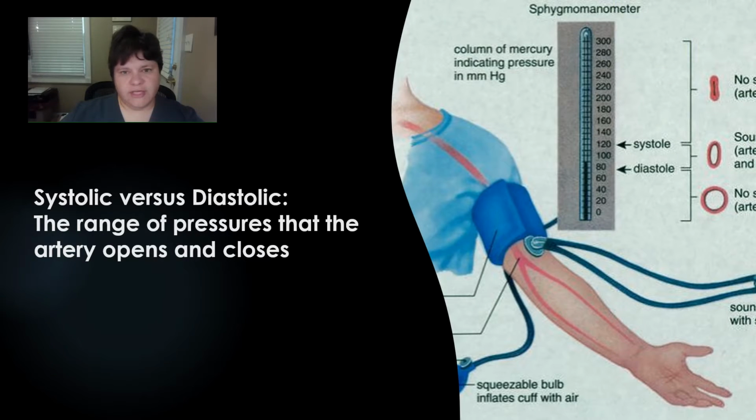When you first start taking the blood pressure, you should pump it up roughly until you can no longer feel the radial artery. That's going to be the artery or the pulse point at the wrist. Deflate the cuff and re-pump it up to that point. Listening very carefully with your stethoscope, note when you first hear the heartbeat. That is going to be your systolic.